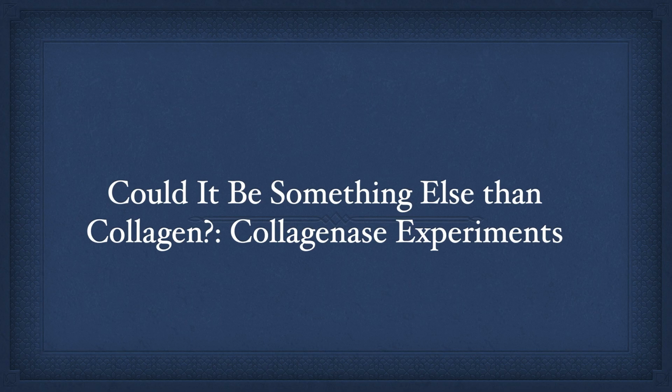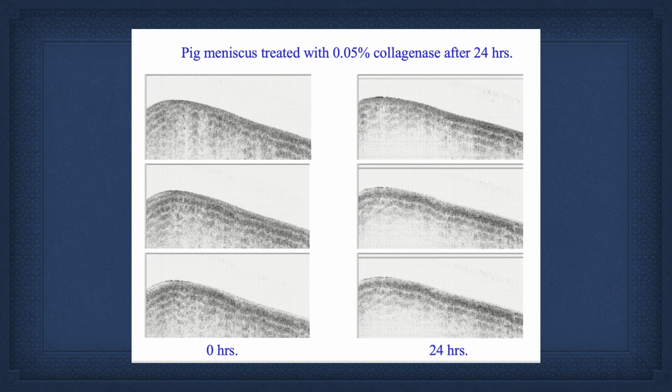Could we do something else? Let's try the collagenase experiment. And these are challenging because collagenase isn't a small particle. So we did do it with acid and it worked, but that's not specific to collagen. On the left, this is unpublished data. It's not from that paper, but it can be found in that paper I referenced earlier. But these were not used in any paper.